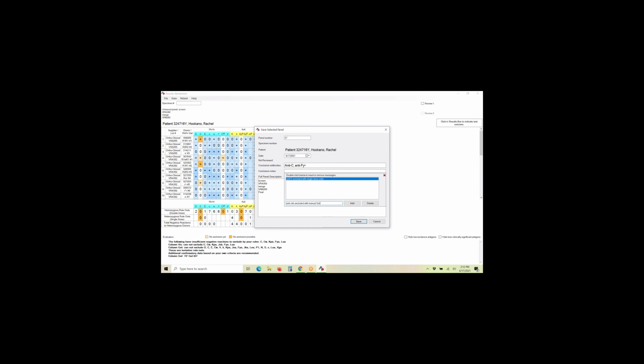I mean, you could also run an Vision, but I'm just saying manual gel because that's how I put it on the column. It's because I clicked that, that's why that comment came up.